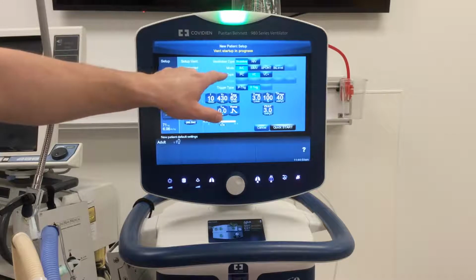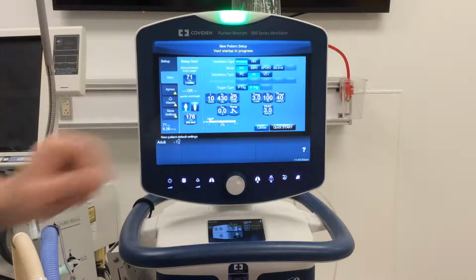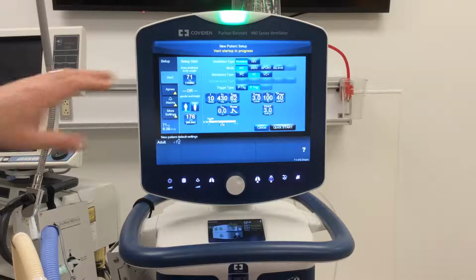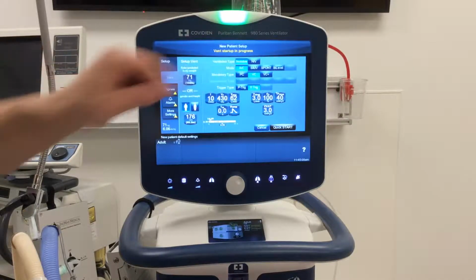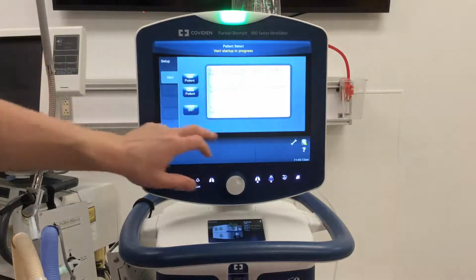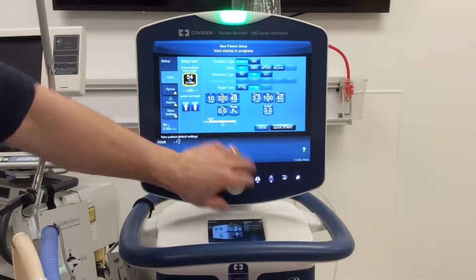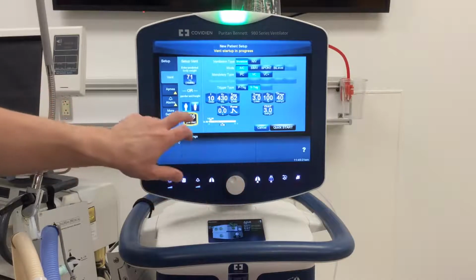One thing I do want to make clear is once we choose the mode, people make the mistake of forgetting that we can choose the control variable that we would like to deliver in every mode of ventilation. We're going to stick to the tried and true here, but just to show you, we could choose to deliver a set amount of, hang on. Didn't mean to do that here. Let me go back and get our 69-inch patient here.